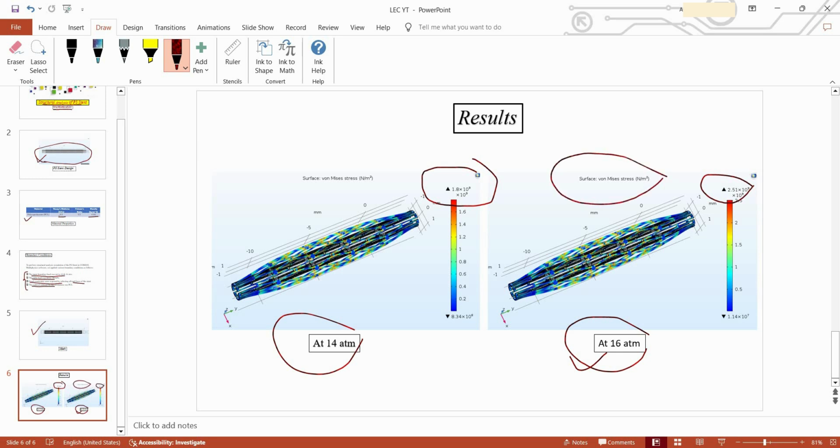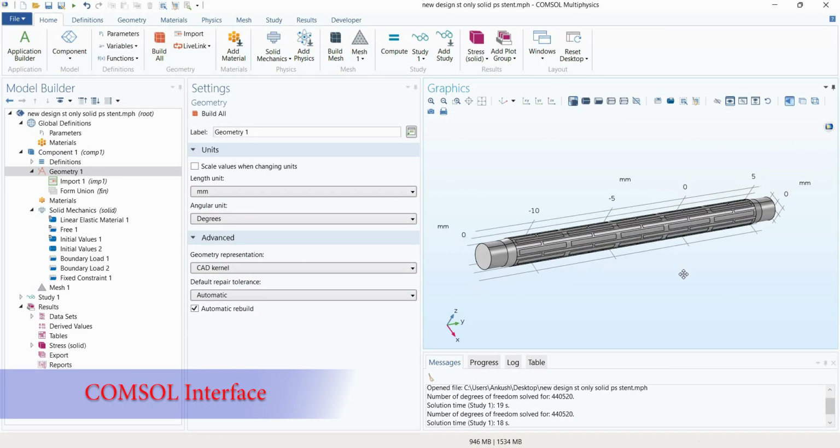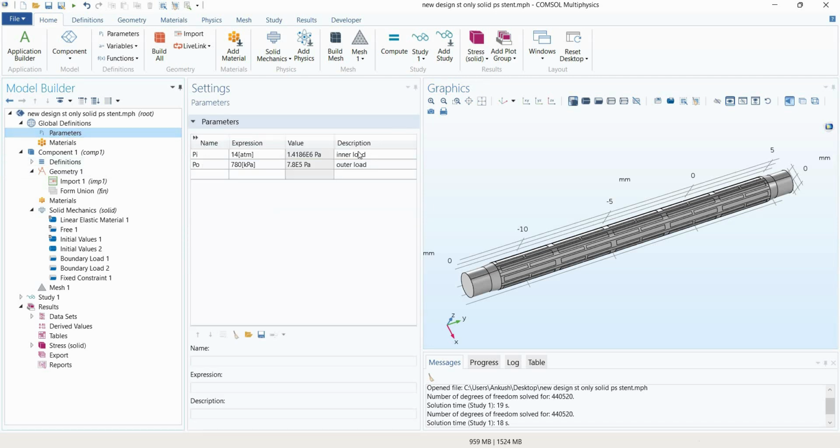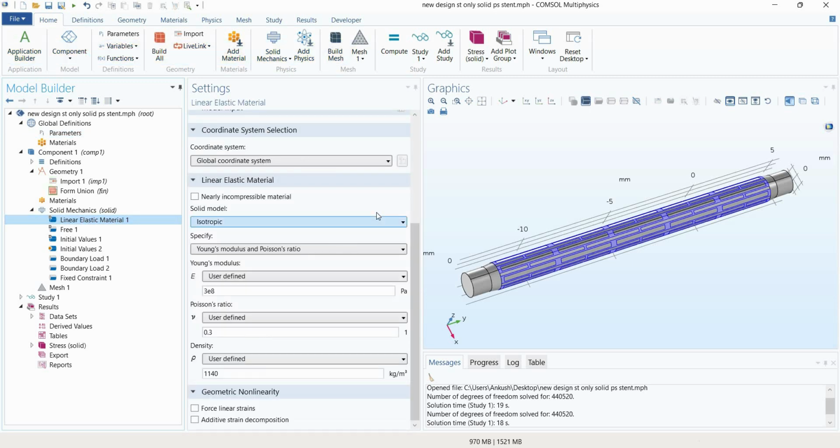Now we are going to perform this simulation in the COMSOL software. This is the stent design, as you can see here, which we have imported. In the global definitions, just click on the parameter section and define the inner load and the outer load. We are taking inner load as 14 atm, which we have already mentioned, and outer load as 780 kilopascal. Then we click on the linear elastic material property, in which we are going to select the stent, and give the properties of polycaprolactone.